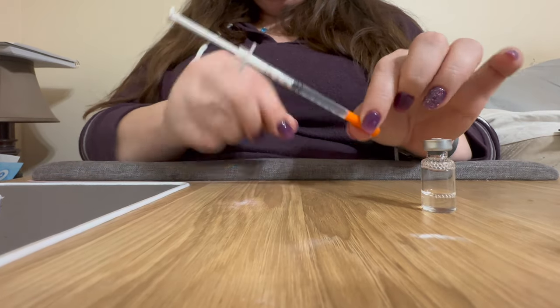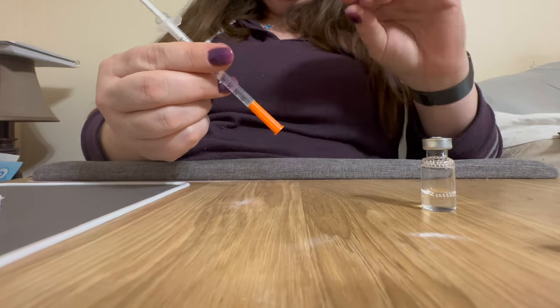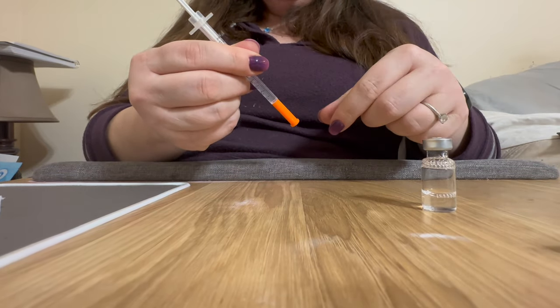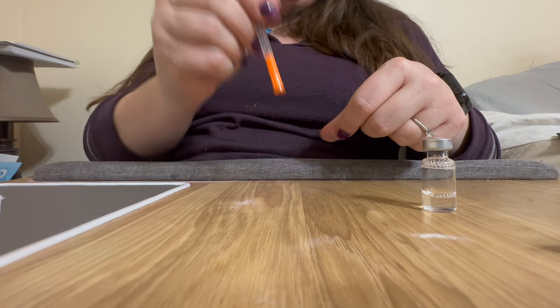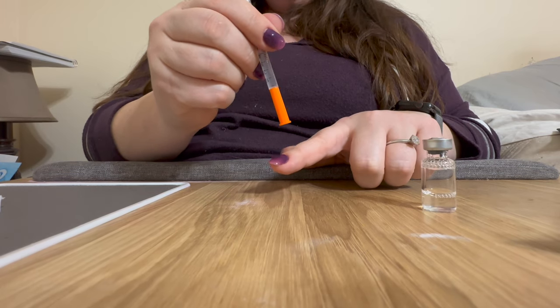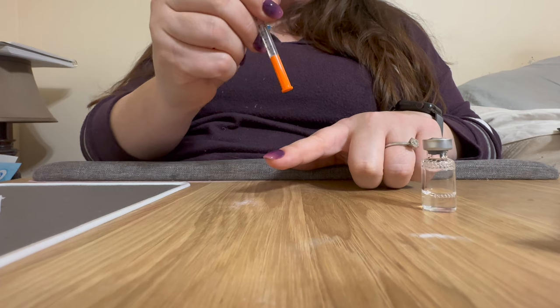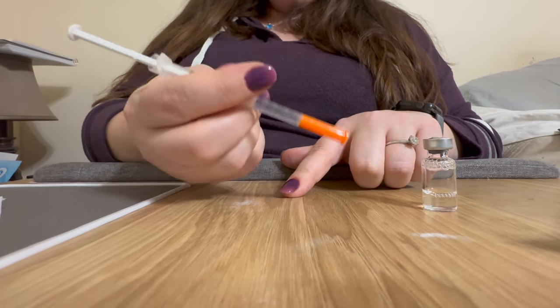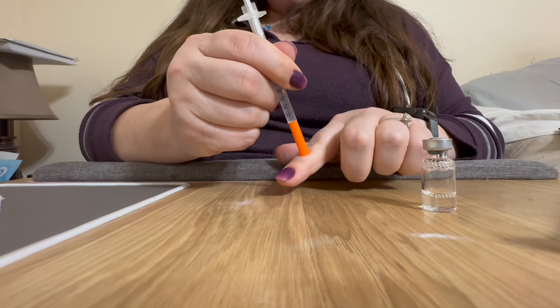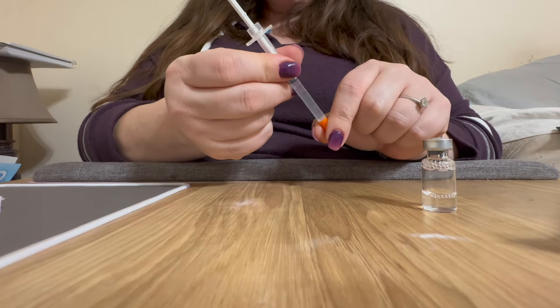The injection is super easy. After you've cleaned the area you want to inject with the alcohol pad, remove the cap. The only difference between pushing the auto button and doing the self-injection is that you kind of act like you're throwing a dart — don't try to go super slow until you break the skin. If you're nervous it will actually hurt more that way. If you just press it in steadily with some purpose, it'll go in without resistance and you literally won't even feel it. These needles are so small. Push it in slowly, press the plunger down, leave it in for about 5 seconds, then remove straight out. Recap carefully so you don't accidentally stick yourself, and dispose of in a sharps container.